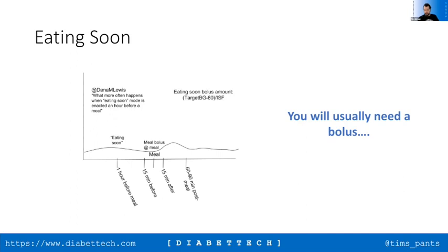So the 2 things going on are that you're getting a small amount of insulin, and you're getting it with a prediction that's going to run out over quite a long time period, so that when you come to your meal, you've actually got the insulin on board, and then you do a meal bolus without that insulin to top up, if you like, so that you reduce the postprandial high.